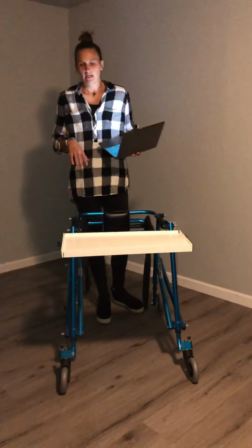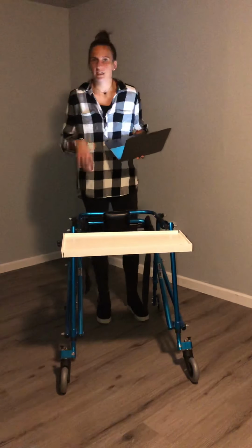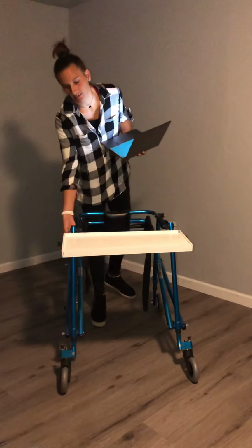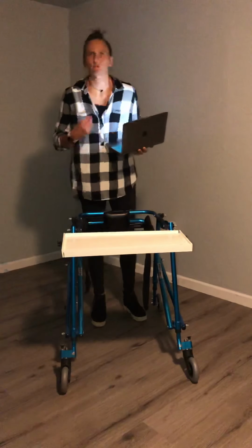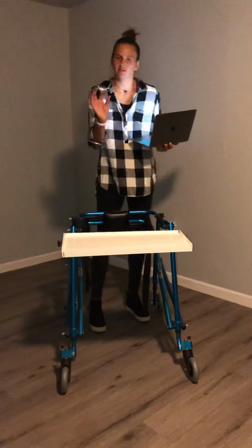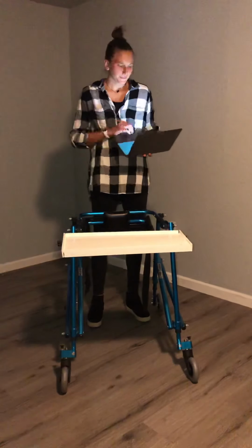And then once I nailed and glued everything, I painted it white, and then I attached the silver brackets to the bottom here, and then the black bracket to that, and that's what actually attaches to the walker. And it doesn't screw in anything, you just tighten this little screw, and this rubber piece tightens up against the leg, and then it stays in place.